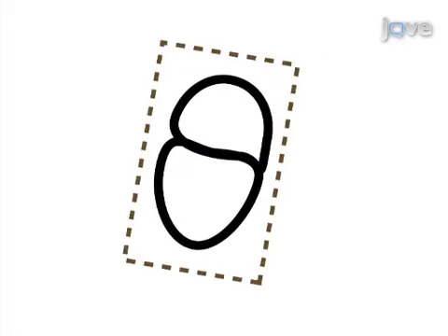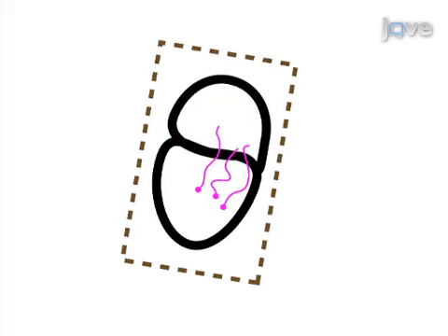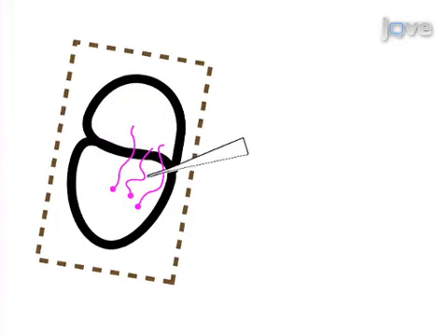The second step is to use tungsten wires to place the fluorescent dye in the region to which the target neurons project. Next, the dye is retrogradely transported, resulting in selective labeling of the projection neurons. The final step is to record from the labeled axon of the individual projection neuron.